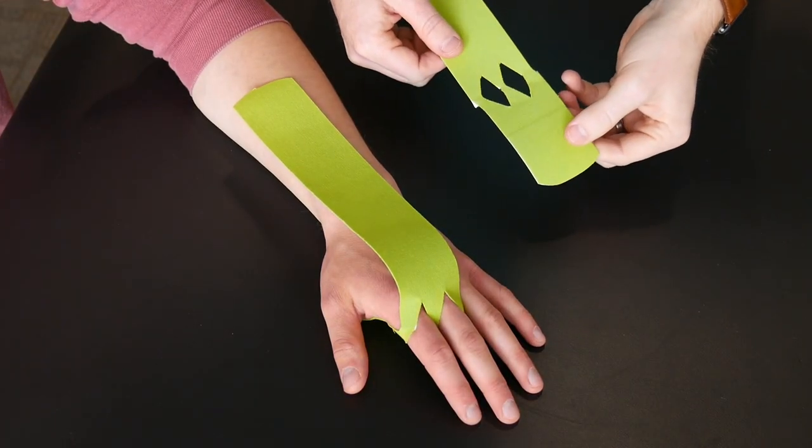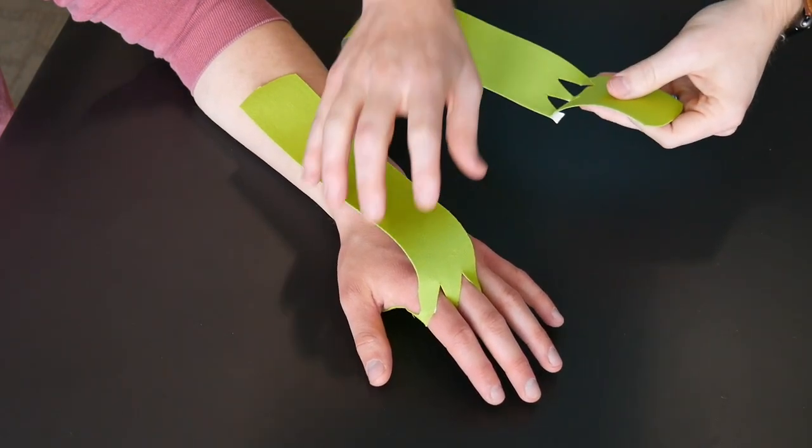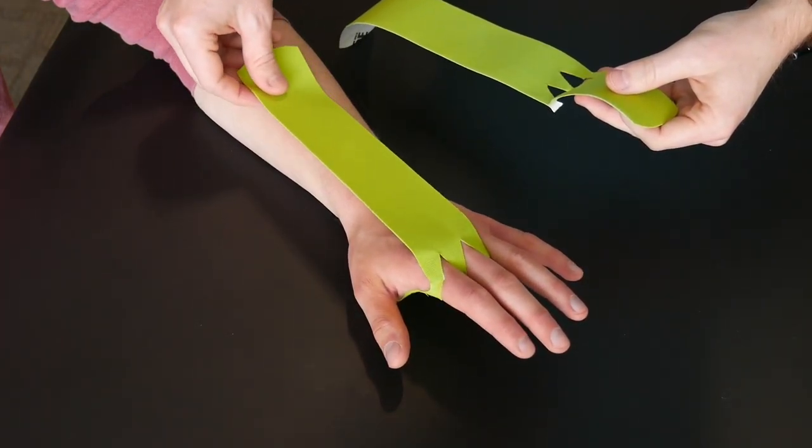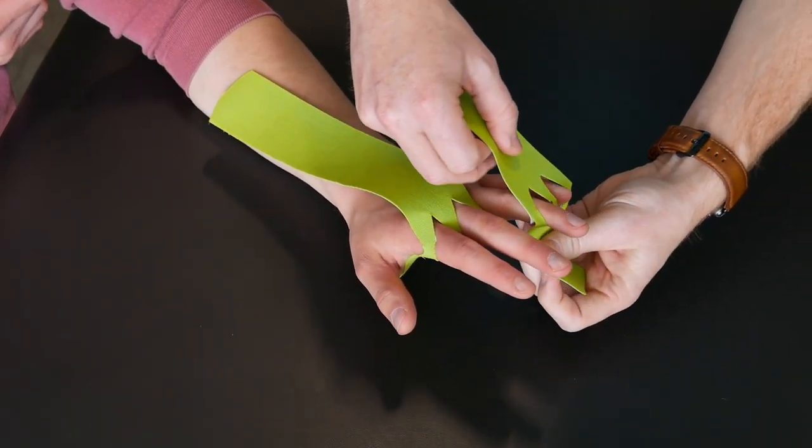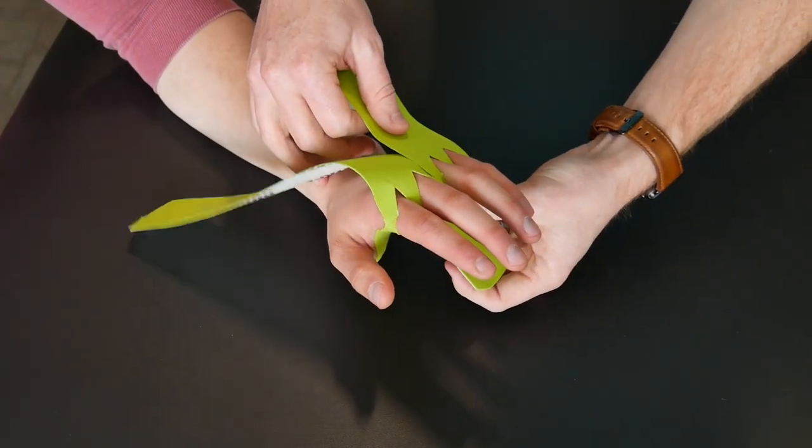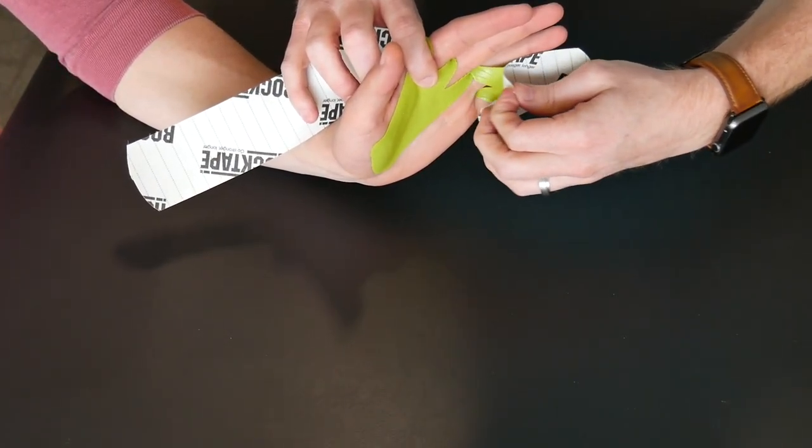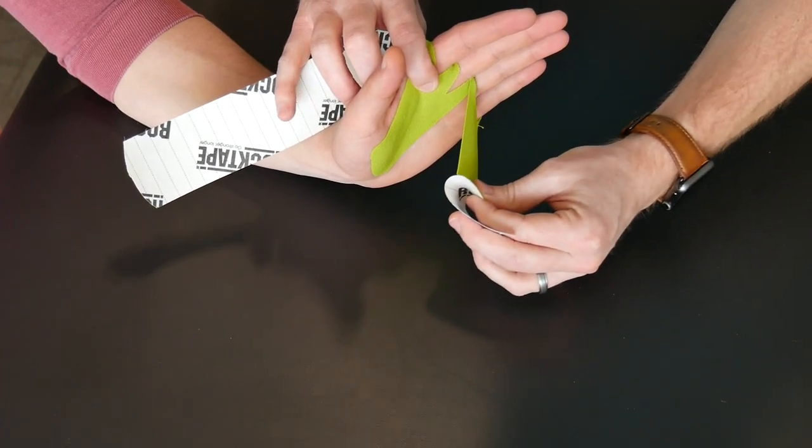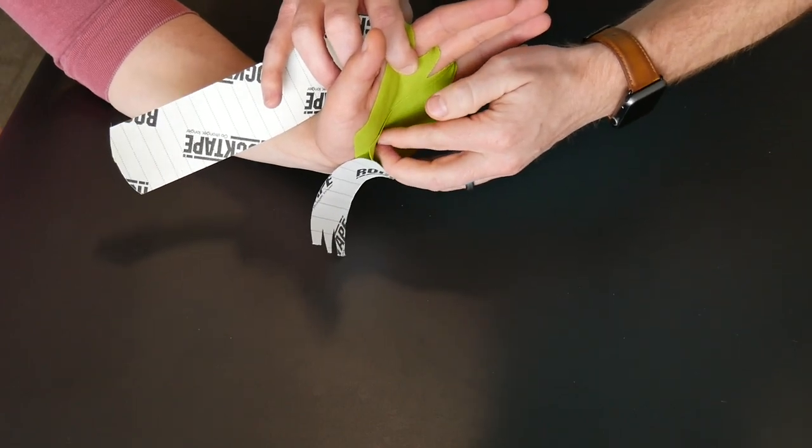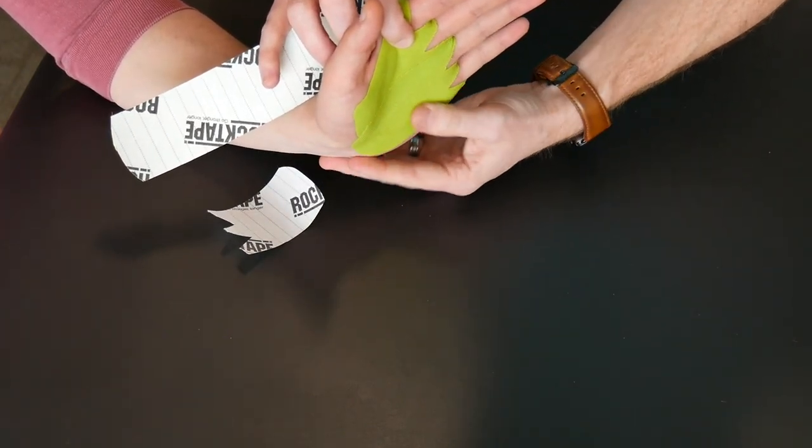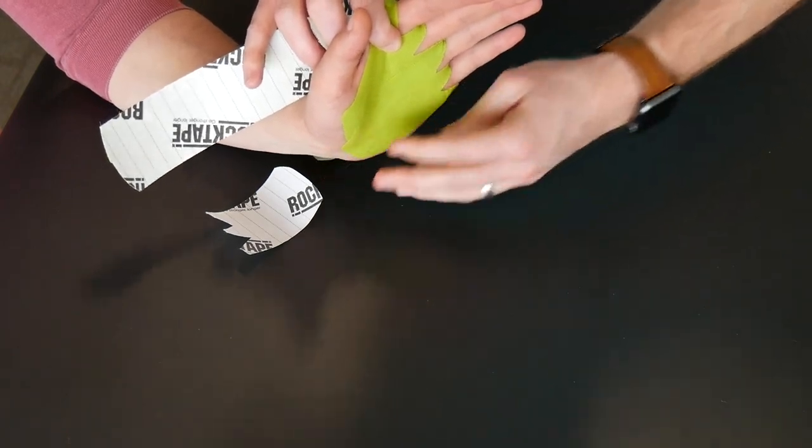So I've went ahead and prepped the other piece of tape as well. So we can go ahead and thread that so we can pull both of these at the same time. So let's go ahead and take his ring and small finger, thread that through. Going to take backing off of that tape and again anchor it to the palm of the hand on the anterior surface. Rub that in really well.